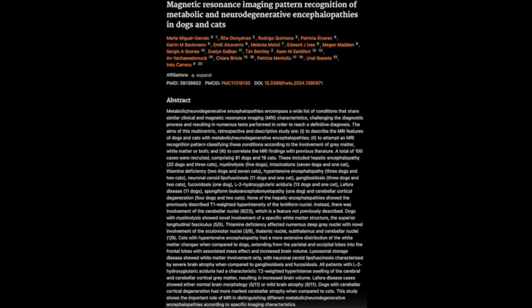Right, like we're so used to seeing those T1 hyperintensities in the lentiform nuclei that we don't even think to look elsewhere. Exactly. And this study reminds us to keep an open mind, to be willing to challenge those long-held assumptions. To think outside the brain, so to speak. I like that. Okay, so cerebellar nuclei in hepatic encephalopathy. Big surprise. What else stood out to you?